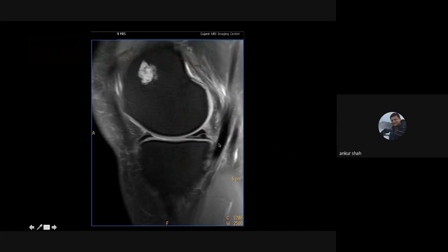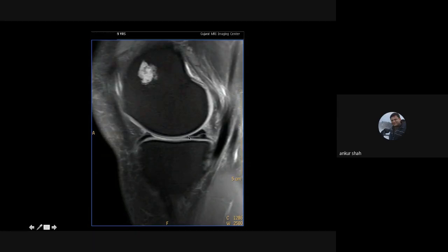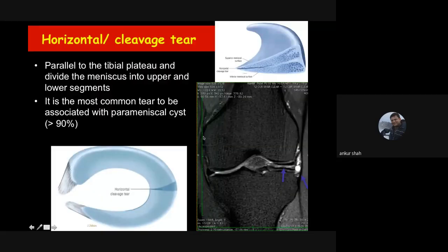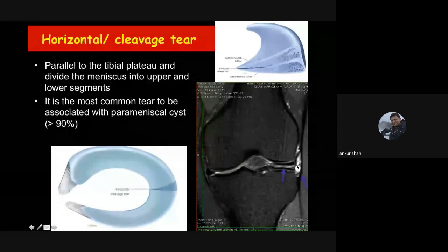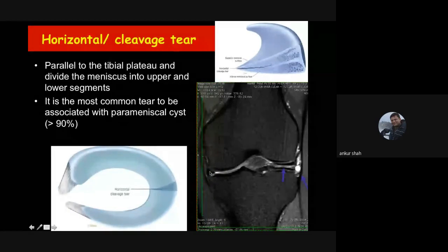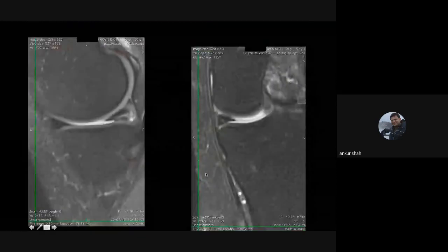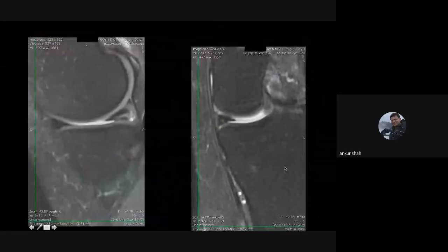The horizontal or cleavage tear shows a focal horizontal hyperintensity extending from anterior to posterior, dividing the meniscus into superior and inferior halves. This tear can occur without damage to circumferential or radial fibers and is seen in degenerative changes. These tears are most commonly associated with parameniscal cysts — more than 90% of parameniscal cysts are associated with this horizontal tear. The meniscal substance comes out and forms a cyst, which can occur in the lateral meniscus too and can form a very large parameniscal cyst.